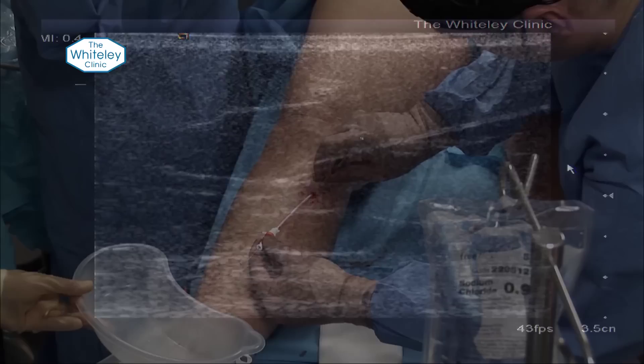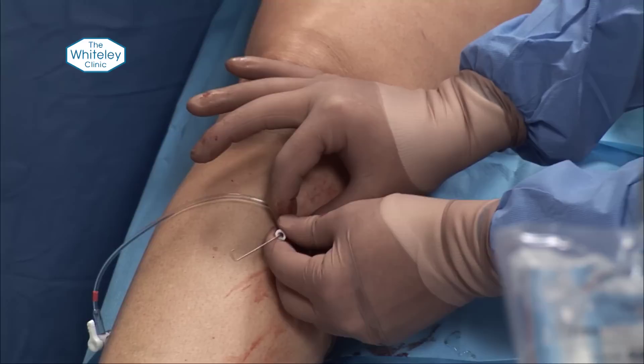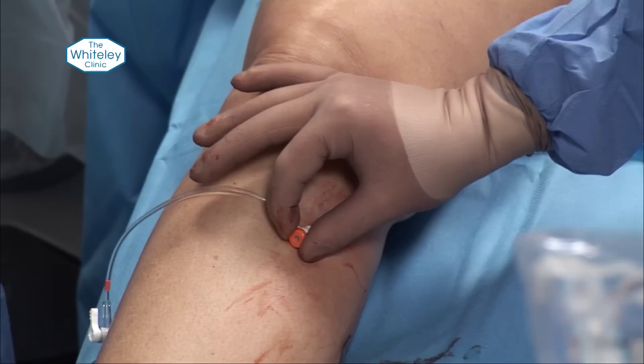We're going to nick the skin as we go through, and that puts the whole of the introducer into the vein. We pull that assembly out — this of course is the Seldinger technique — and then this is the radiofrequency catheter showing the two electrodes at the end.